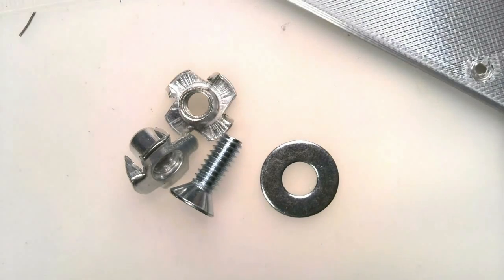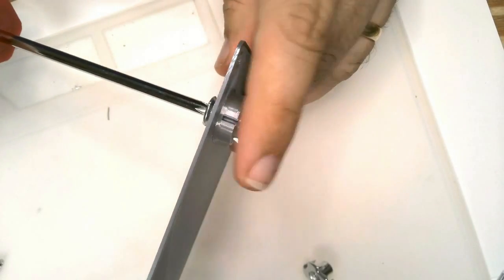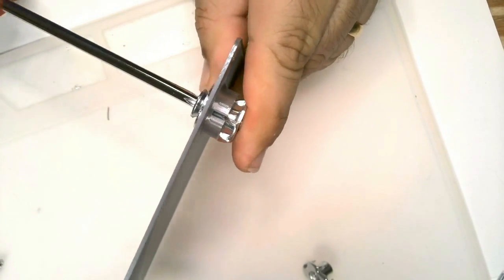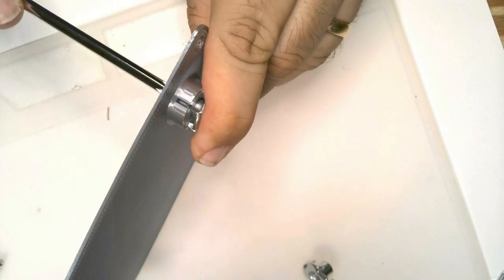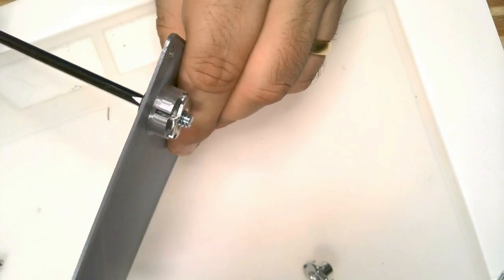This is a 4-prong 1/4-20 T-nut that we're going to secure to the lid. Use a washer and a 1/4-20 screw and tighten it to secure the T-nut into the plastic of the lid. Then back out the screw and remove the washer.